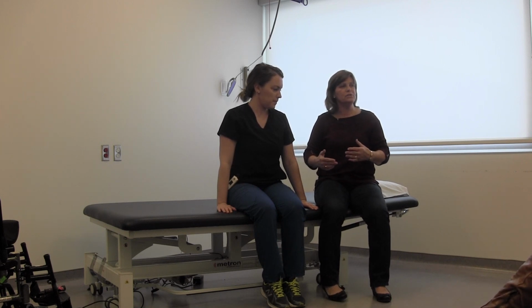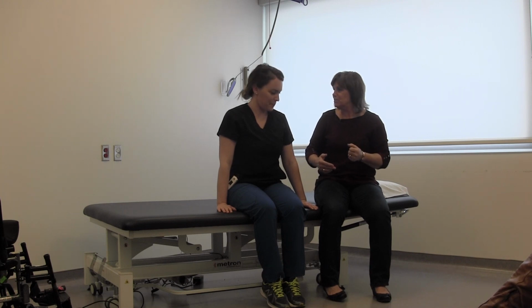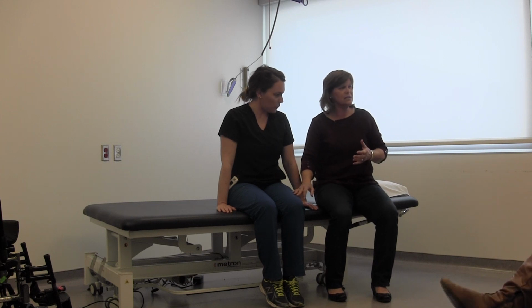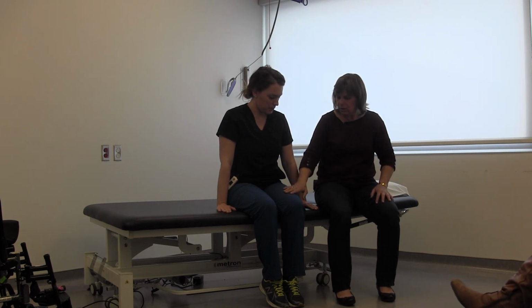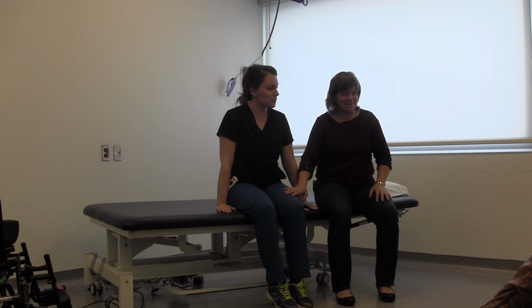The other thing is, as soon as they start coming up, they want to grab to you. Don't let them grab to you, right? You've seen that, eh? Yeah, okay. Any questions? Does that seem pretty straightforward? Okay, so now we're going to get her set up for the transfer. So this is where all of you guys get to participate.